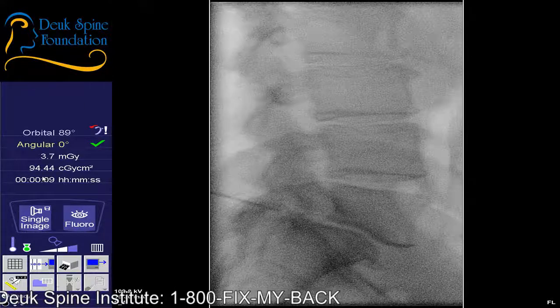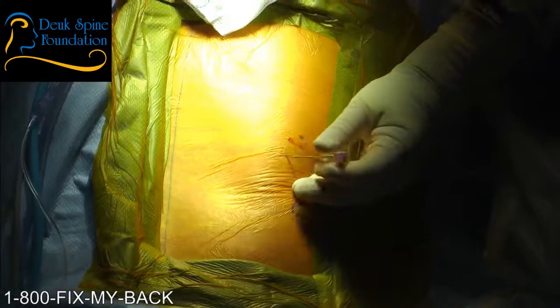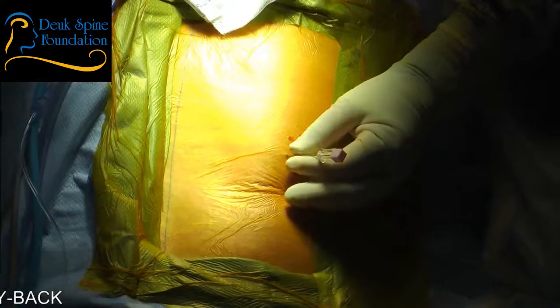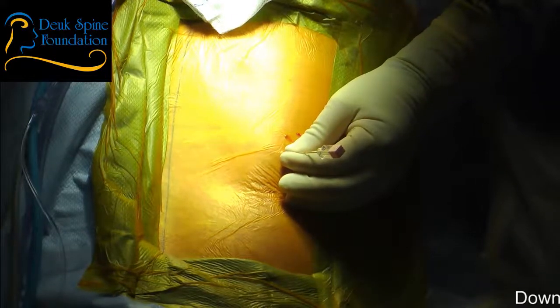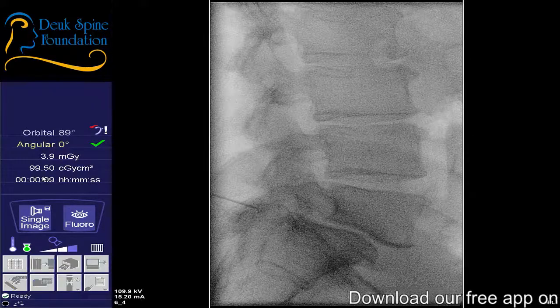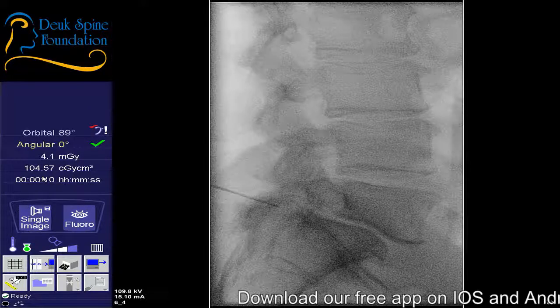Everything good over there? Maybe we could drop that a little bit. Okay. Just lay still. You're doing good. I know it's a little bit uncomfortable. Shot.